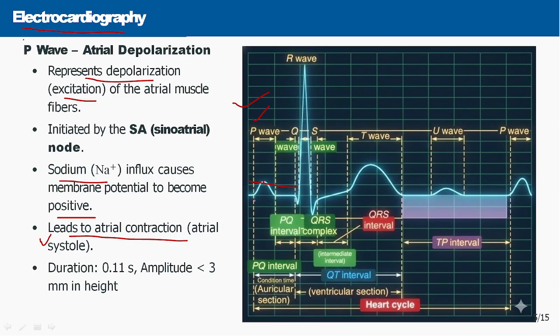This duration will sustain for 0.11 second and the peak amplitude will reach up to 3 millimeter in height. So, this is all about atrial depolarization.